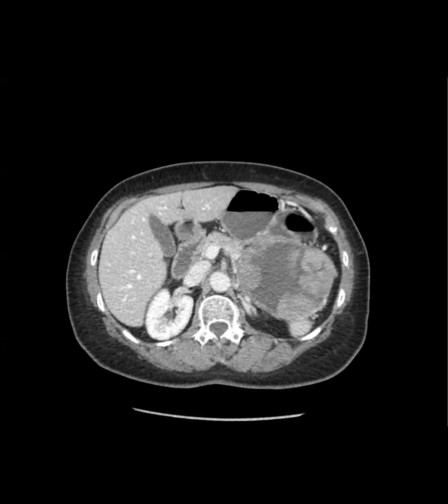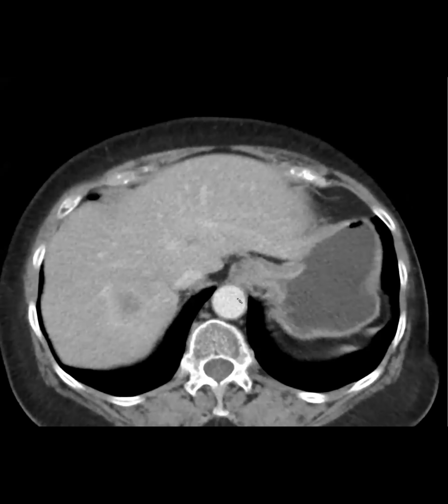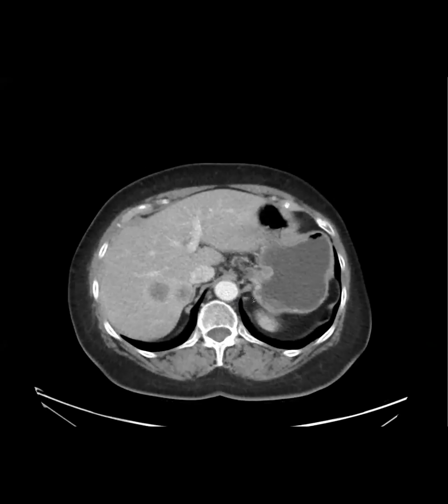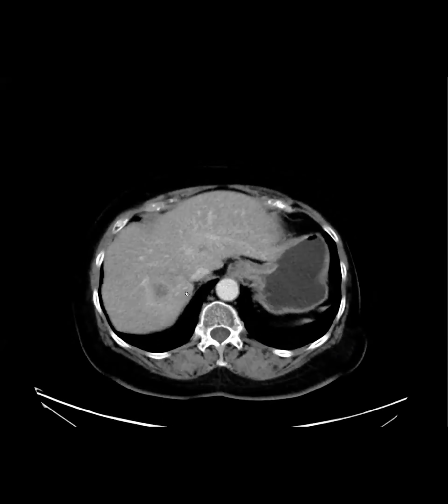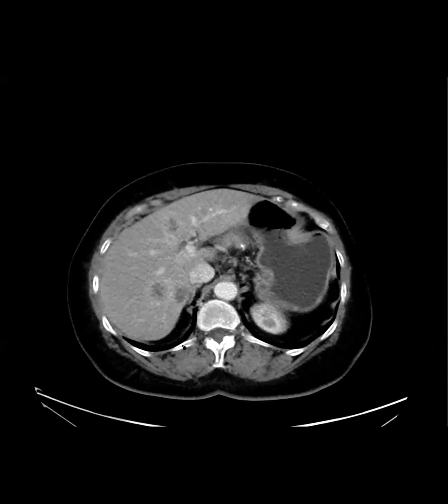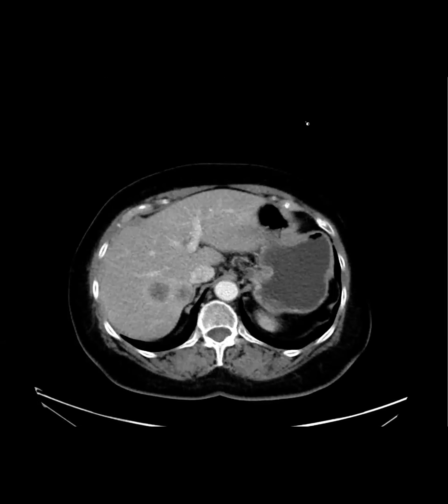So this patient, they resected her pancreatic tail acinar cell tumor, which is the treatment if it's restricted to the pancreas. She developed liver metastases about a year later. But they're actually now treating these liver metastases with chemo, and they're actually shrinking. And you can see she had a distal pancreatectomy. So this patient had acinar cell.